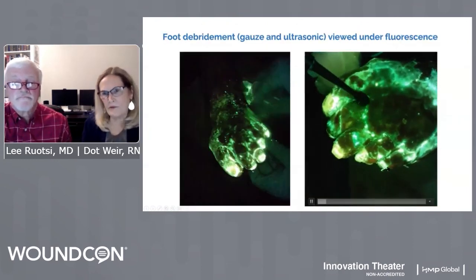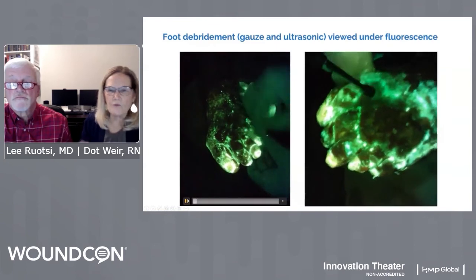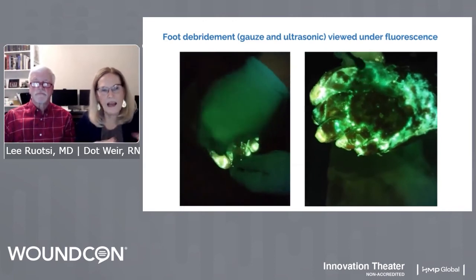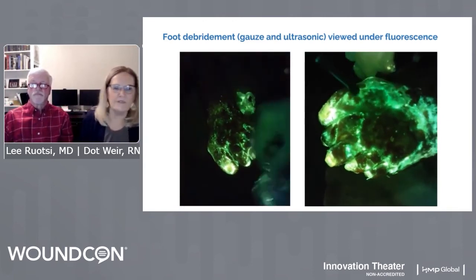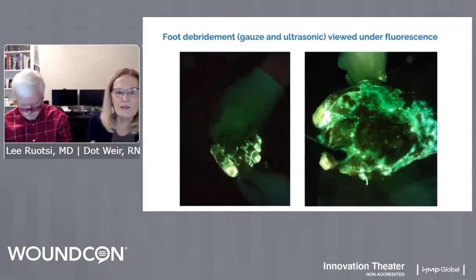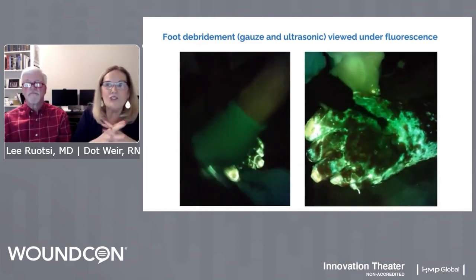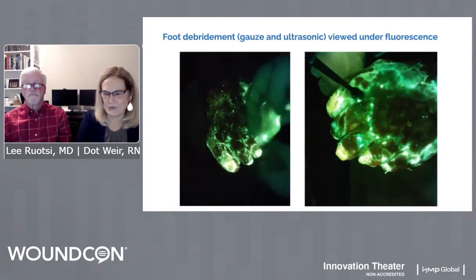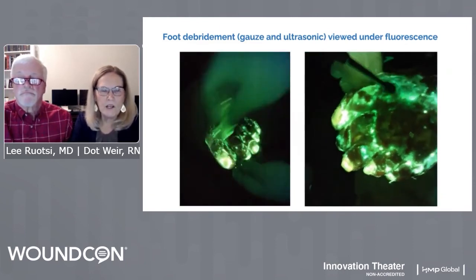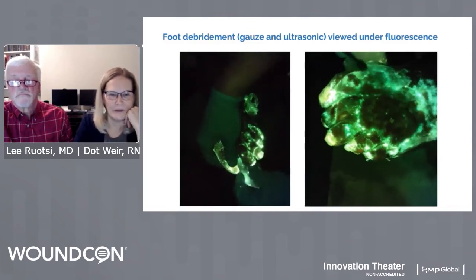This is another example using ultrasound on the same patient on a different day. I'm trying to get all this dry skin from between his toes, but look at my fingers, look at the gauze, and how much bacteria is there as we're cleaning. This makes the point: change out your gauze frequently as you're doing cleansing. When I move my hand, you'll see behind it all of that fluorescent gauze that was in the tray underneath his feet in our podiatry chair. Using the ultrasound makes it a whole lot easier — you can see all of that just flowing off the surface of the wound.